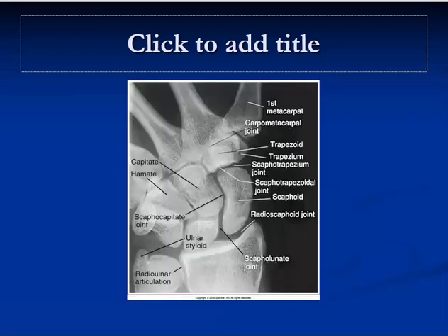So one thing that I've seen with the collimation beam restriction for a scaphoid or a navicular view is that the technologist or student wants to include an area similar to what you would see in a wrist, and there's just absolutely no reason for that. The only bone that you're looking for is that bone right there.